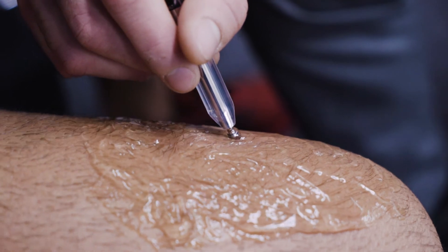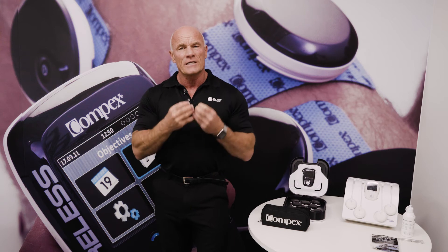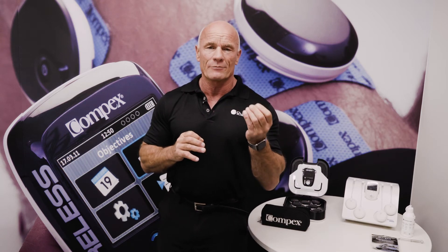Compex supplies you with a motor point pen — a small instrument that allows you to locate those motor points. In another video, I'm going to show you how to use the motor point pen to look at things like AMI, Arthrogenic Muscle Inhibition. I'm sure you've had patients where 99% respond really well to your exercise prescription, but there's that one who doesn't — and you know they're compliant. So what is it? Probably AMI.